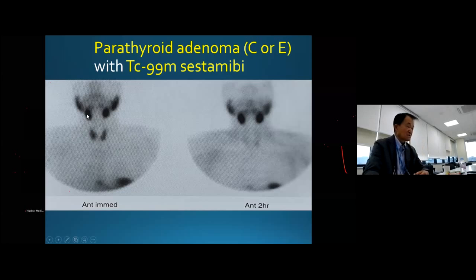So using sestamibi, you can see parotid gland, submandibular, sublingual is in the middle. It's so small, maybe you don't see it. The thyroid, just like a parathyroid, isn't trapping things. It's just uptake, maybe a normal tissue in the immediate phase, right? After injection you can see some certainly blood pool effect.